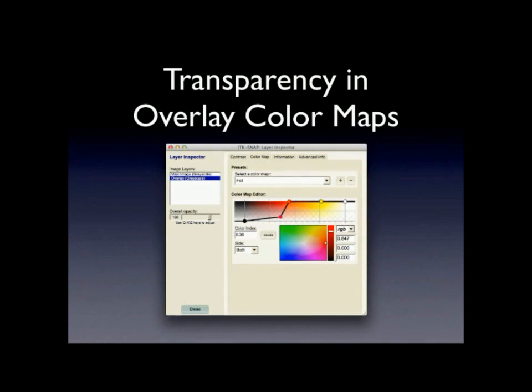When we work with overlays, it's very important, again, to set up transparency well, because if we just load an overlay on top of an existing image, we're going to hide the first image. So in order to visualize them effectively, we need to change color maps and play with the opacity. So one thing we can do is, in the color map editor, we can make a portion of the color map transparent. So the y-axis in this little color map picture here is the transparency.